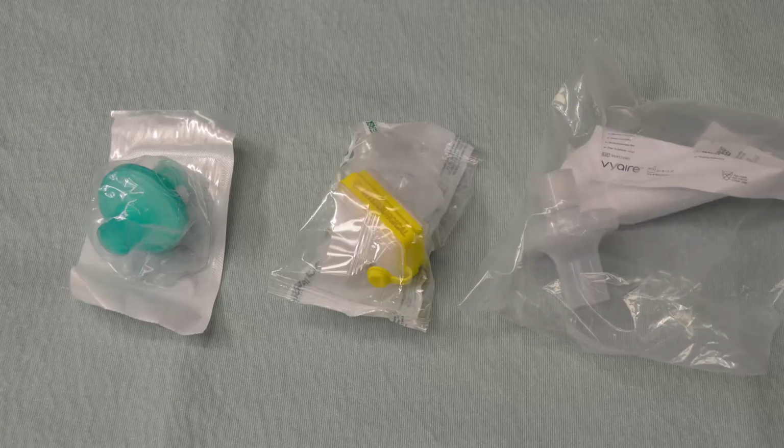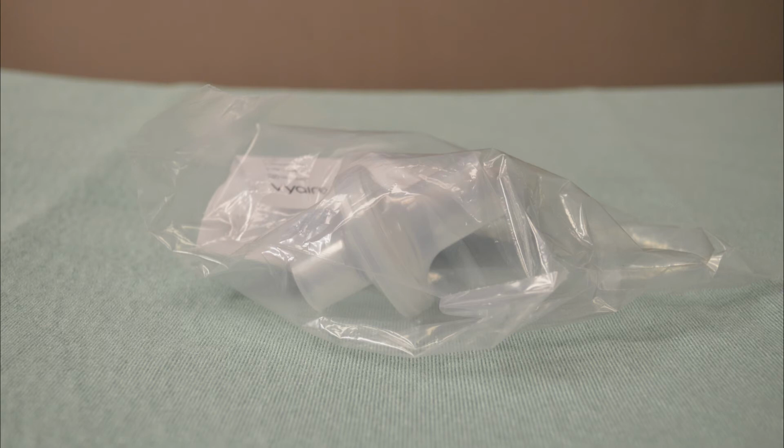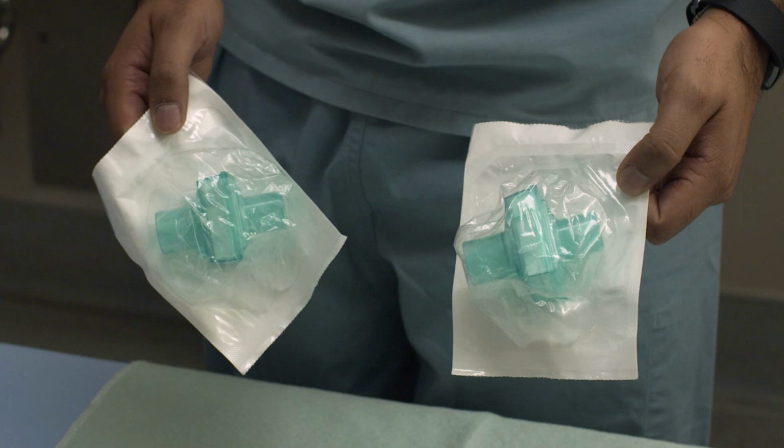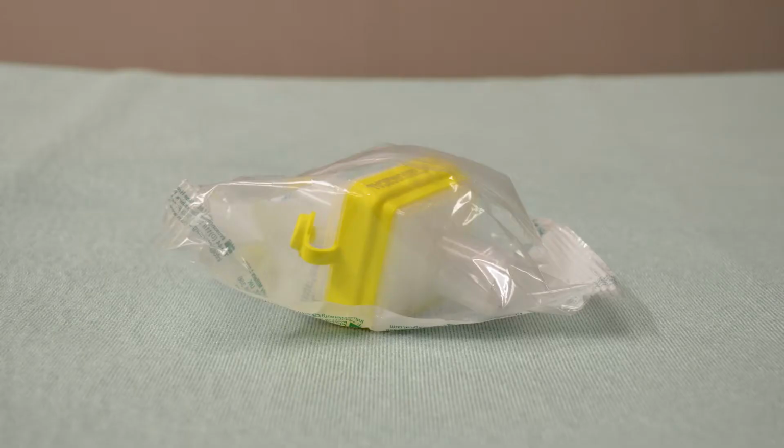The antimicrobial filters in our department have changed a number of times, and they can be confusing. So to keep it simple, the white circular filters you find in the bag valve mask bag should only be used with the bag valve mask. The green circular filters found on the RT cart are being phased out as they are less effective when wet. They can only be used on the ventilator itself. And the square filters, which can be green or yellow and white, are found in the airway bags and can be used anywhere in the ventilator circuit or on the bag valve mask itself because they are still effective when wet.